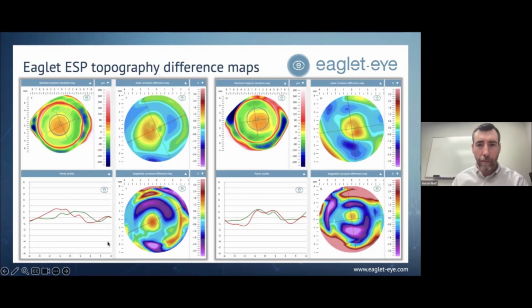as opposed to your traditional myopic maps as well. When you're looking at this particular pair of eyes, you're going to see that the right eye has a larger warm spot in the middle, a larger treatment zone, essentially a hyperopic treatment zone in the middle. And on the left eye, you see it to be much smaller. As I mentioned, going back to the Wave designs, we did that intentionally, bringing those points of curvature closer together. You can see that also reflected in the power profile map. The power profile map from side to side is more compact than it is on the right eye, which is wider.